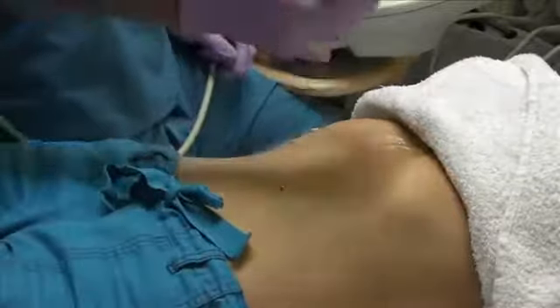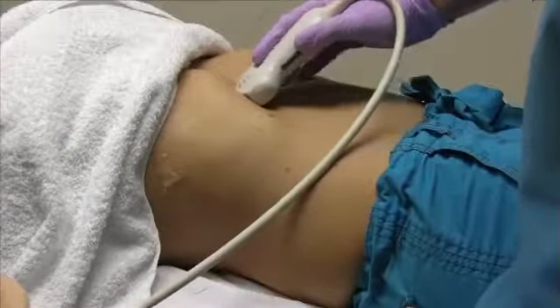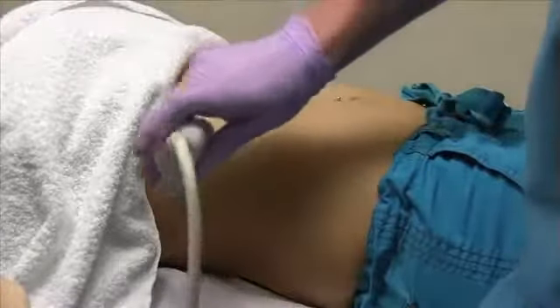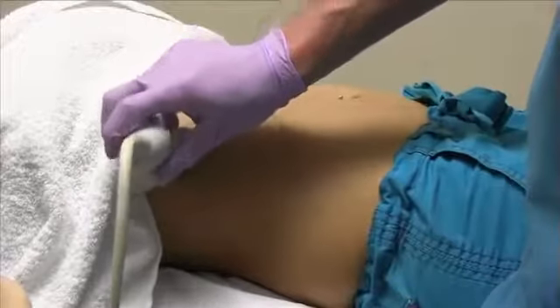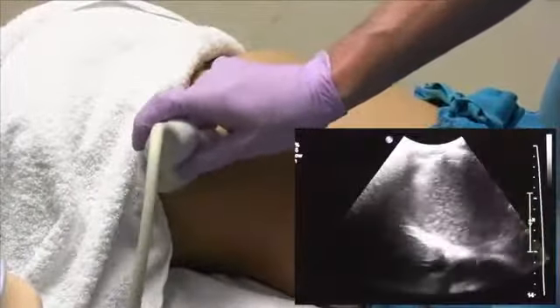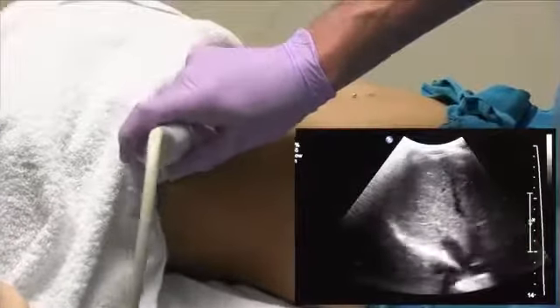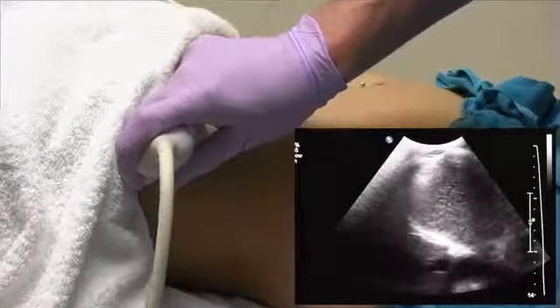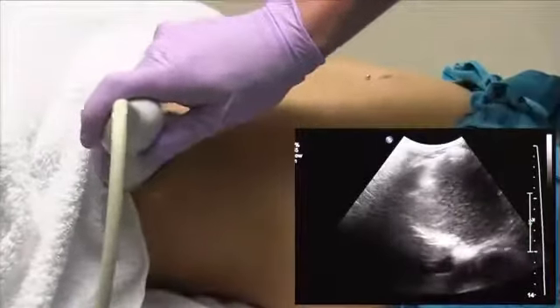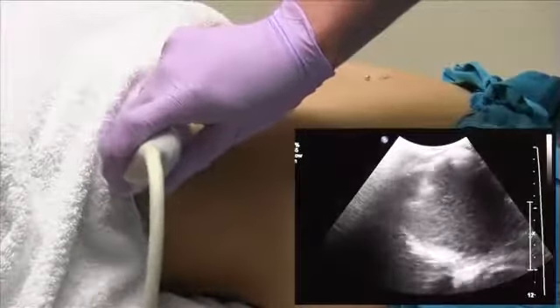and now we're going to go to an intercostal window. So after you finish your transverse sweep subcostal through the right lobe, we're going to move to the intercostal window. And for this window, you're going to want to make sure that your probe is slightly obliqued, because you want to fit in between each one of these rib spaces to get the best view of the liver. And you start again up at the top of the liver, and you sweep through the top rib space here.